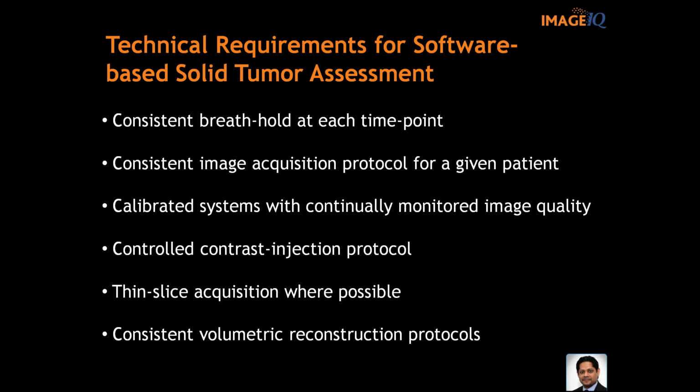Matt, one thing on this that makes me think, big picture, is that CT is really evolving and is highly, highly variable now across different centers. I mean, there's dual source, dual energy, and all these things, and you really need someone who knows what they're doing when you're planning the trial. It's not just about making a simple size measurement anymore. You do need to factor in all these different things in the protocol. You need someone on your team that knows what they're doing with CT.